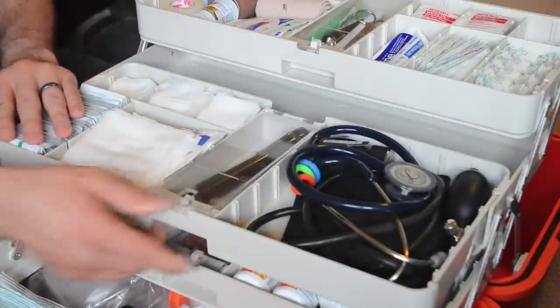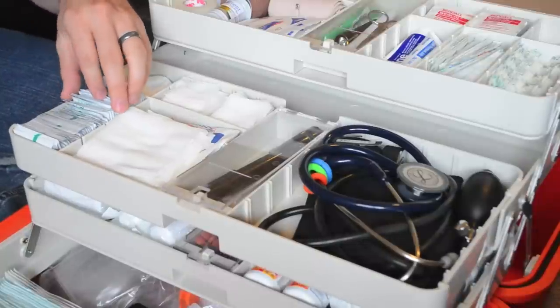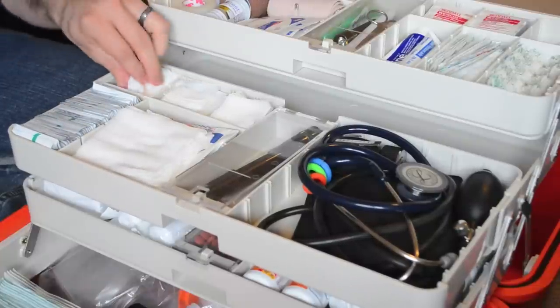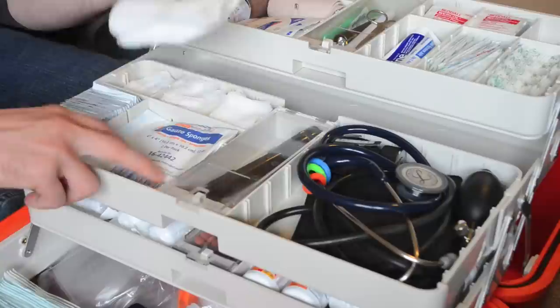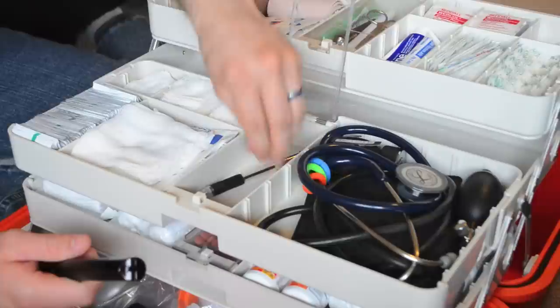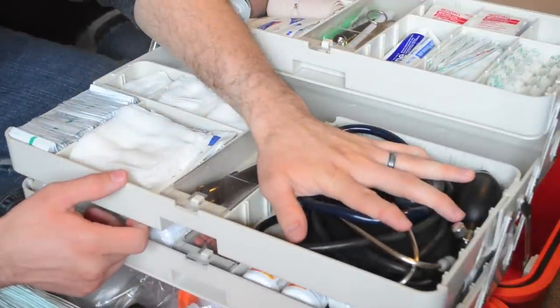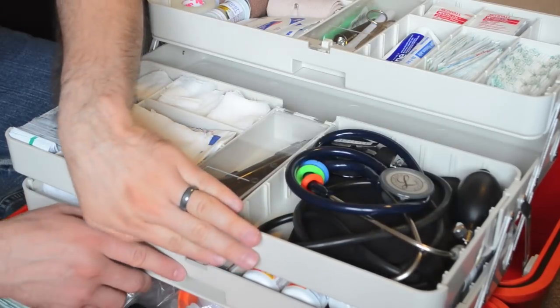The next drawer down I've got some more bandaging stuff. Over here, a lot more alcohol preps — it's so good to have enough things to clean wounds, and if you're taking blood sugars you'll have plenty of those also. Some non-sterile cotton swabs, non-sterile gauze, and then some 4x4 sterile gauze. In the center compartment here I've got a flashlight that can be used as a pen light, and then some pens if you need to take notes or write down vital signs. Over here is some of my diagnostic stuff — I've got a Littmann stethoscope and a blood pressure cuff. That's it for the second tray.